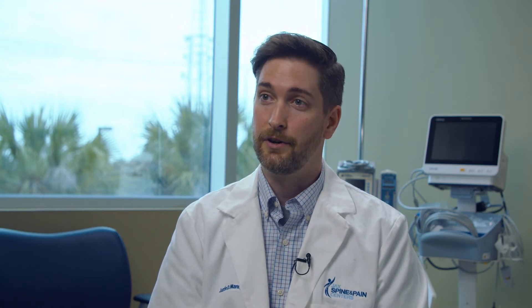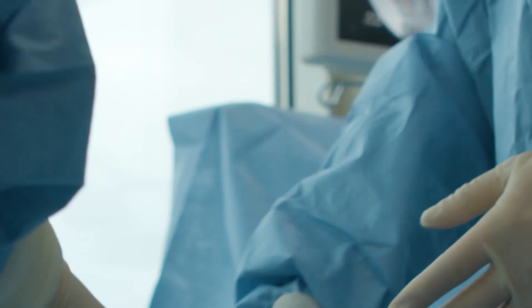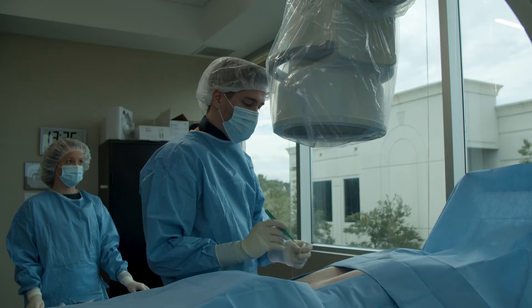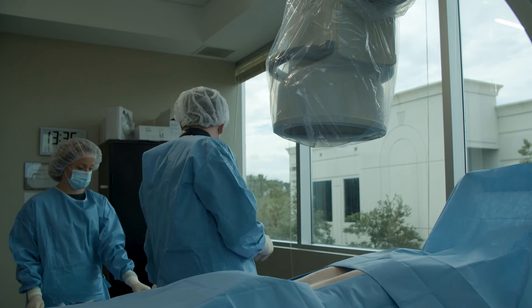Once the overlying area is numb, then we get to work. We make a very small incision — it's less than the width of a fingernail. It's not even an incision that we use a suture to close in the end; in fact, we close it with glue.